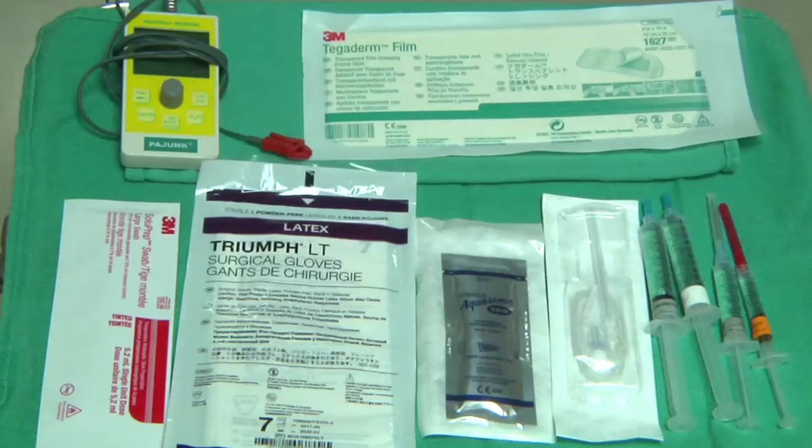For a typical block, we require various equipment. These may include chlorhexidine for aseptic precautions, sterile gloves, a Tegaderm, an ultrasound machine. You may wish to use a peripheral nerve stimulator, sterile ultrasound jelly, a 22-gauge short-tip blunt needle, and required local anesthetics and sedatives.